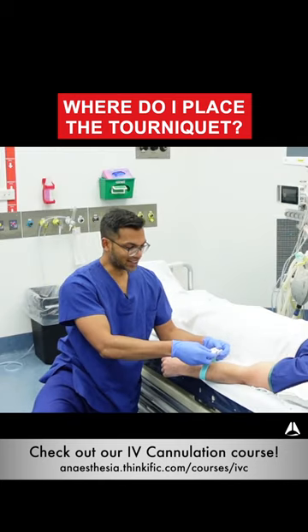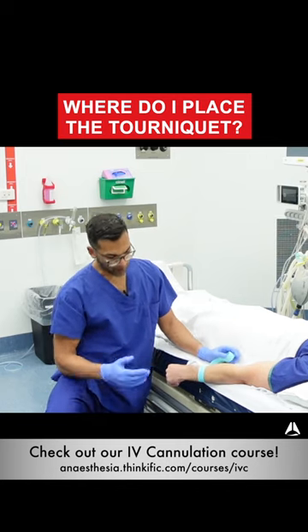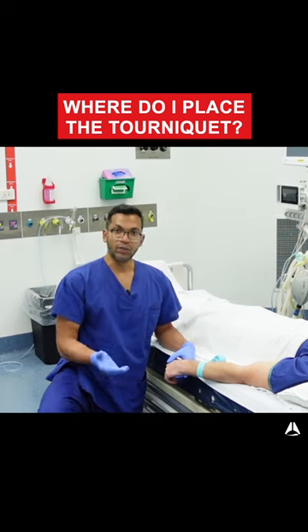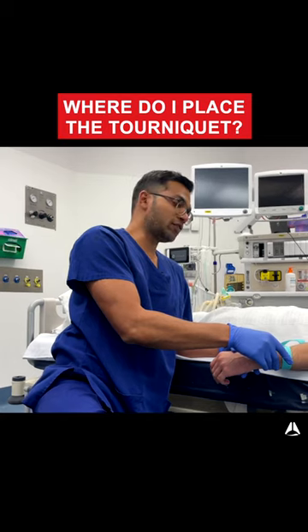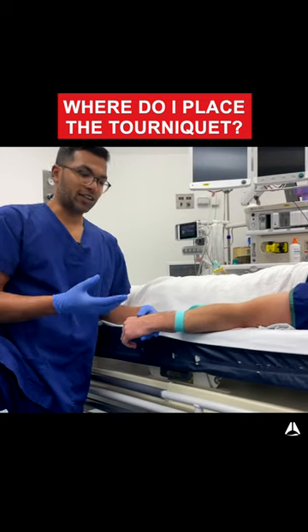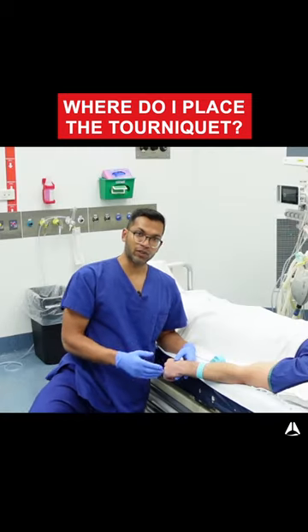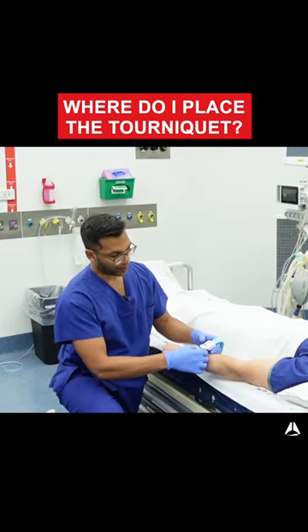One of the other things you might see is someone putting a tourniquet on the forearm, and that's completely fine — you can be absolutely successful doing this. Just know that if you do that, a patient with good veins it'll be no problem. But there is a potential that because there's two bones in the forearm, the radial and the ulna, there's some veins that will traverse in between those bones, and these veins might be uncompressible. So it's important to know that you may still have some venous backflow, which is not what you want. Therefore, for most cases, I put the tourniquet up around the arm.